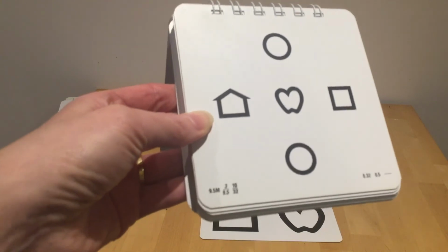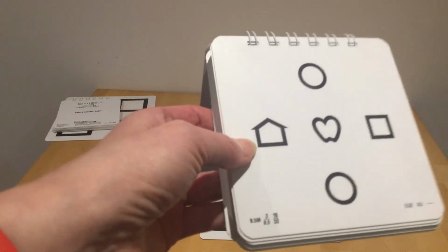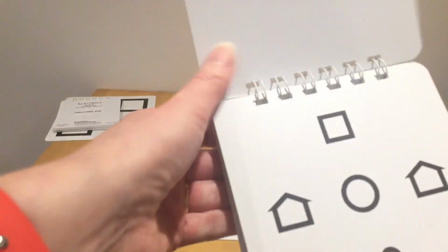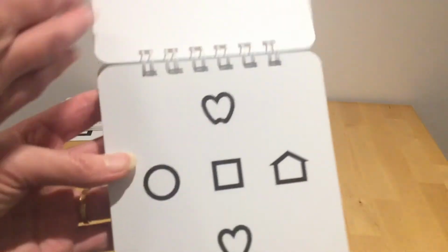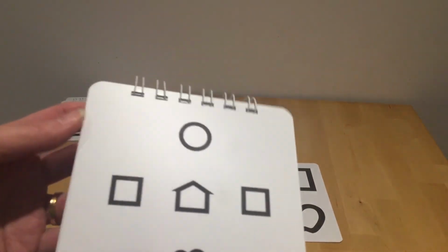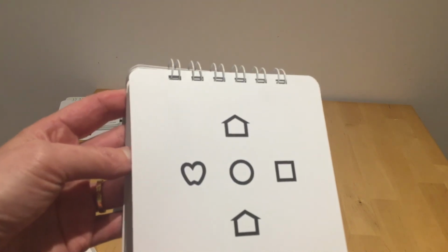And how this is done is you are advised to ask the child what is the symbol on the left. So this one here, just beside my finger. So we're only wanting one of those shapes to be called. And again, what's the symbol on the left? So the house. This time it's a circle, so it's 3. So if they get it right, you can flip on. So 3 over 7.5, what's the one on the left? It's the heart.